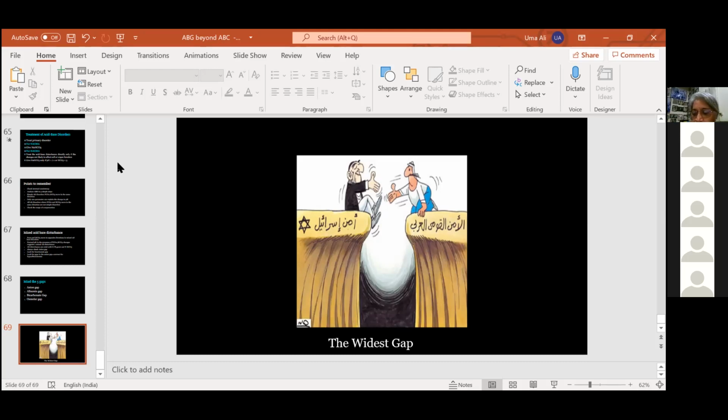So any more questions we can take? Otherwise, we can end the session. Role of base excess in ABG reports. See, I have not gone into it. As I mentioned, there are different ways in which you can approach your interpretation of blood gases. So in the Boston method, which we've used, using bicarbonate and PCO2, we don't look at base excess. In the Copenhagen method, we use base excess and the nomogram to get your answer.